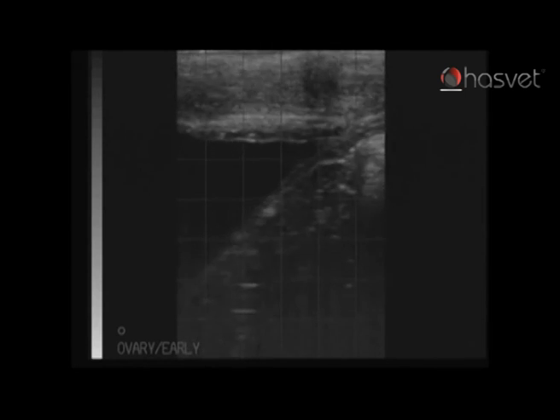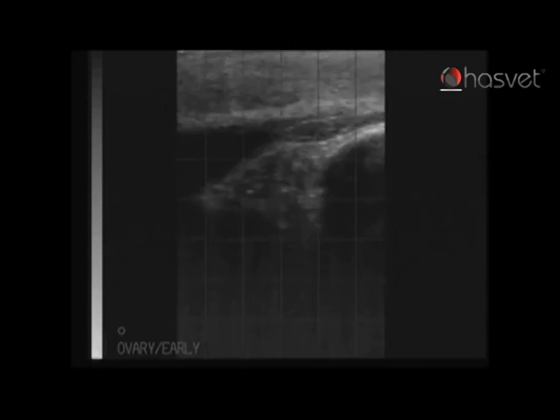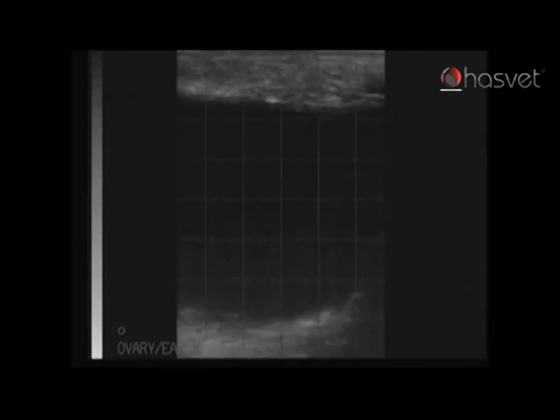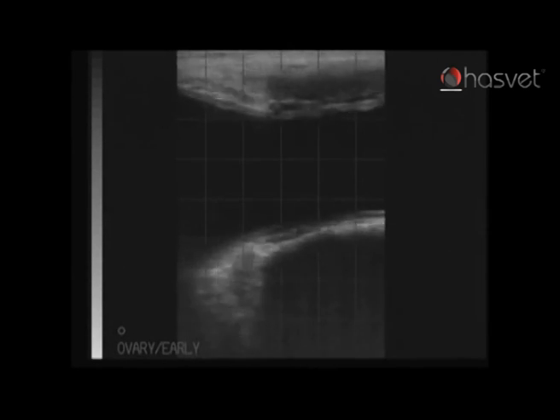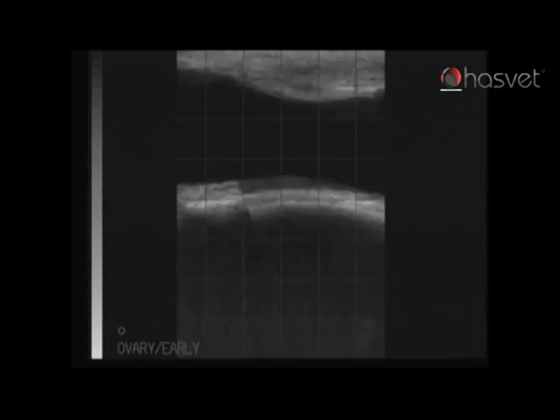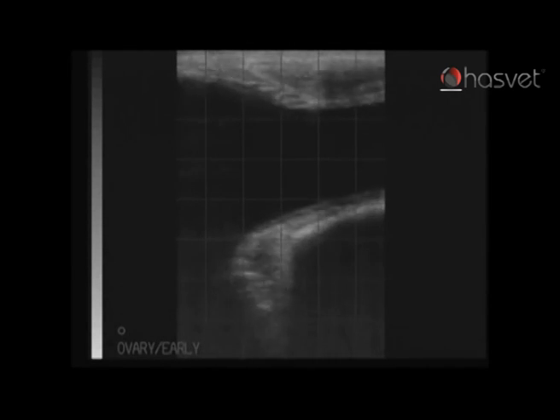I will now describe in greater detail the specific structures which can be visualized on this ultrasound video clip of the pregnant cow. The ultrasound probe has been inserted via the rectum and we will perform a methodical ultrasound examination of the entire reproductive tract, including the cervix, the uterus and both ovaries.